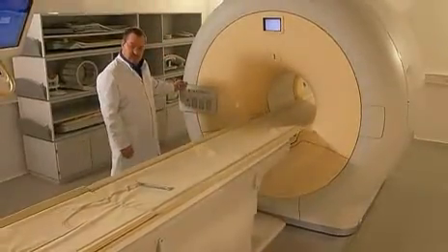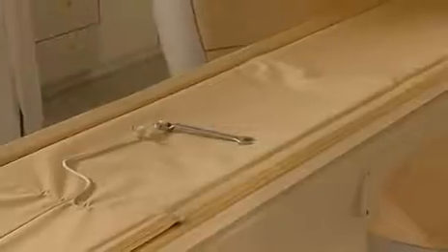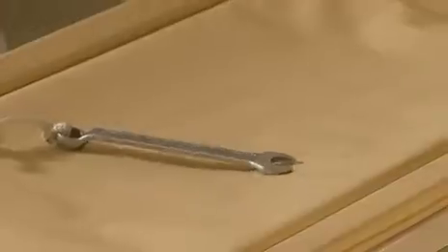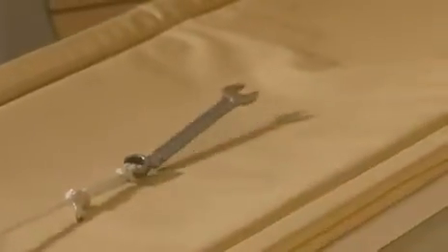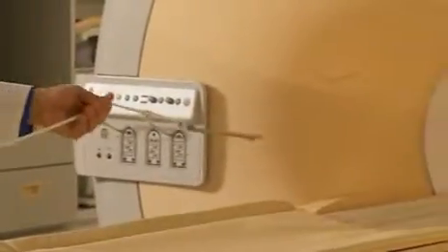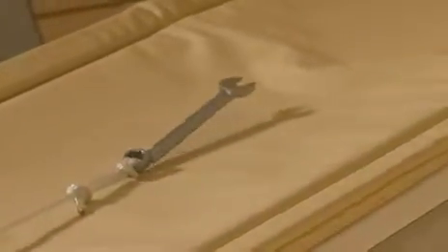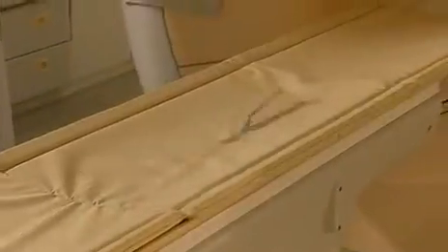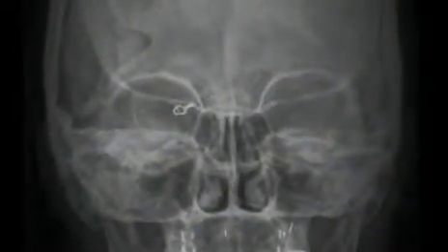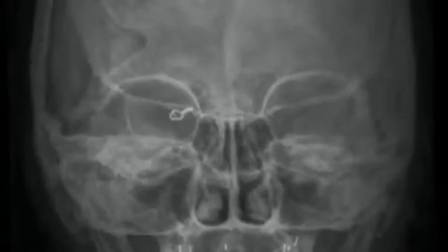The magnetic field also twists ferromagnetic objects into line with the direction of the magnetic field lines. The twisting or torque forces can be dangerous in patients with ferromagnetic implants, because this force can displace the implant, tearing tissue or rupturing blood vessels. Brain aneurysm clips are particularly at risk from this effect.